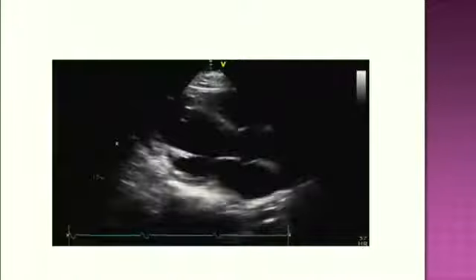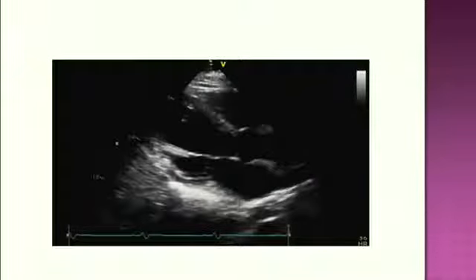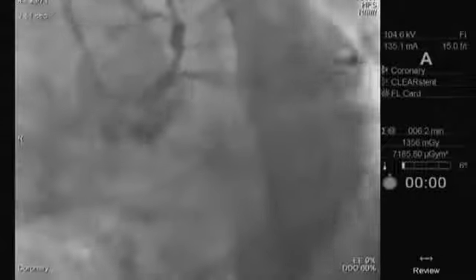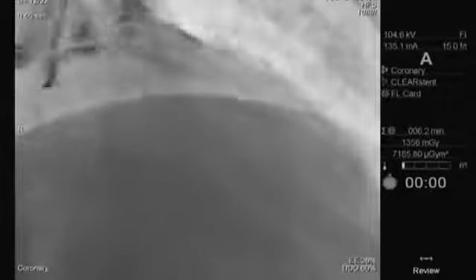So we'll straight away take you to the angiogram. Next, the angiogram, please. And we see this is the view in LAO caudal. So this is the angiogram. Yes, sir. So we have a lesion in the bifurcation of the LAD and diagonal. Both are significantly big branches. We have a big collateral towards the right. And we have a circumflex and an obtuse marginal which has a tight lesion. Can you go to today's? So I'll show you today's pictures and we go ahead with that.